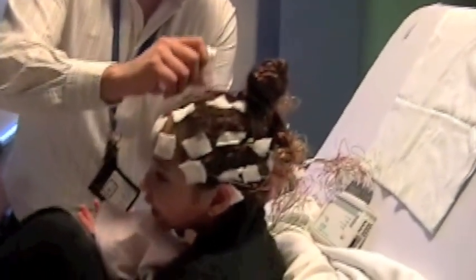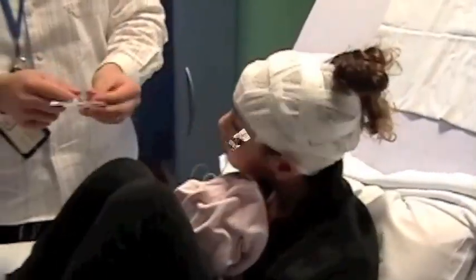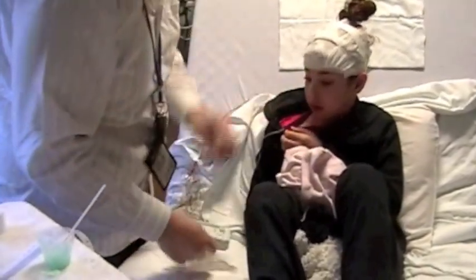One of the final parts of the EEG preparation is getting a big soft bandage wrapped around your head. The technician will also place some tape around to make sure the bandage stays in place — Erin thought that she looked a little silly. Last, you will get a couple of sticky circles placed on your stomach and on your arm to help the technician monitor your heart rate.